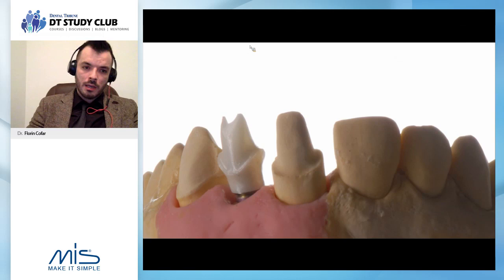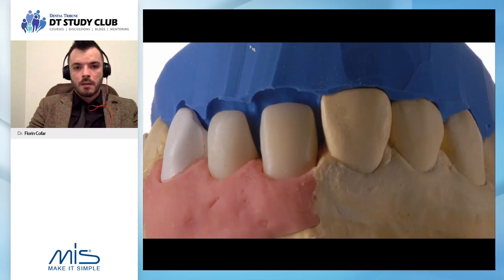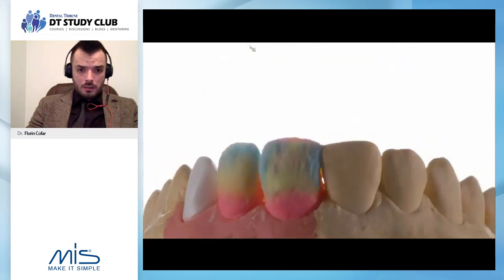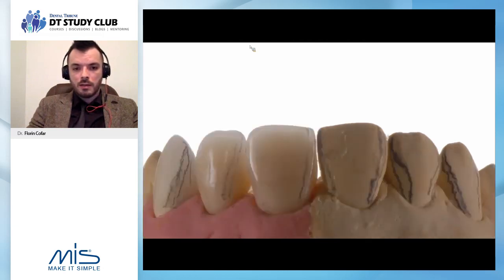So again, we can have a nice alveolar model. This is the ceramic work of Edson da Silva from Sao Paulo, Brazil. So this more or less is what we're doing in single implants in the anterior area.